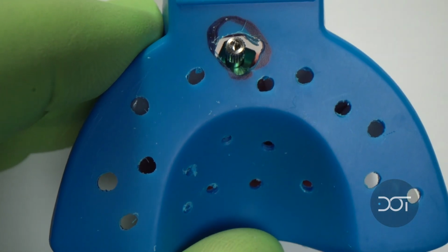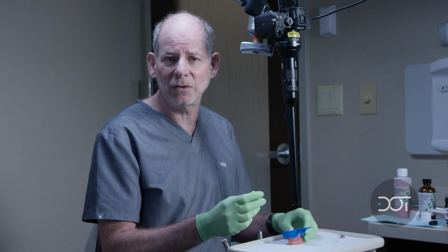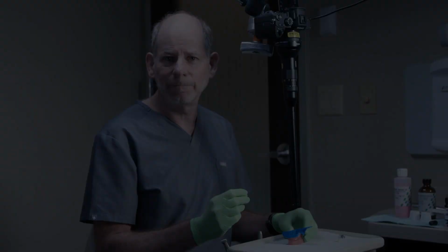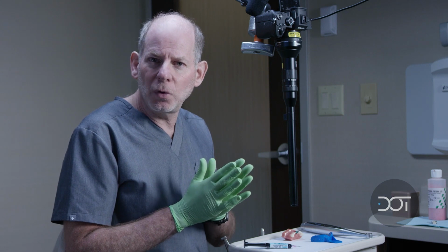So now that we've tried in the tray, let's go ahead and paint the tray with our tray adhesive, so we can get ready for our impression. I want to share with you a tip that I use when I'm doing open tray technique. I use a flexible rubber dam flowable composite material. The material that I use is called GingerGuard from Cosmodent. And again, it's just a flexible flowable composite.